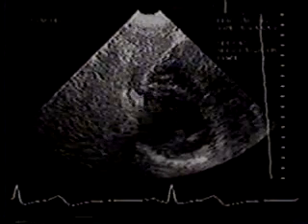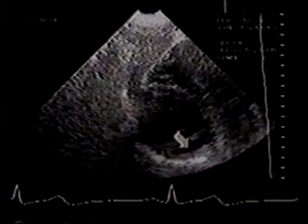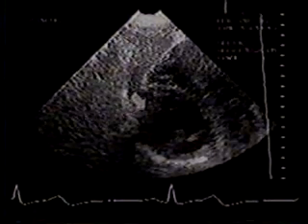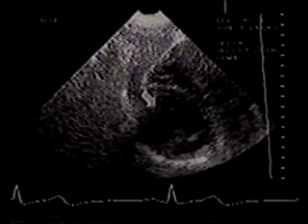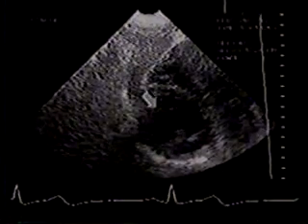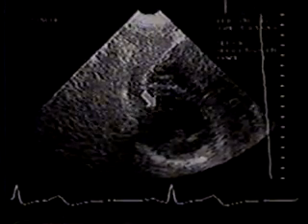This is the inferior wall of the left ventricle, this is the lateral wall, and this is the anterior wall. The inferior wall of the left ventricle and the posteromedial papillary muscle are often partially obscured in this view. This means that this view is less reliable than the parasternal short axis view for the diagnosis of inferior infarctions.